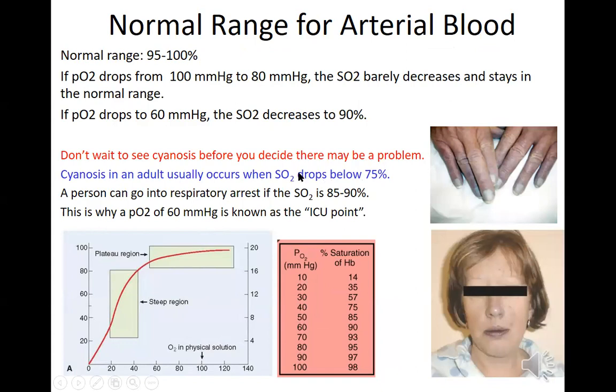On the SO2, remember SO2 is the same as SaO2 and SpO2, but we've already decided that it's a correct saturation. Like we don't have to deal with, well, the pulse oximetry was normal, but is there carbon monoxide poisoning? Is there methemoglobinemia, sulfhemoglobinemia? So if it says SO2, that's the saturation of oxygen. So we decided we're going to live with that.